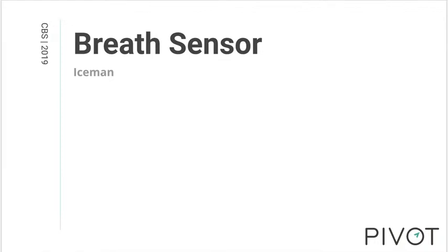In this module, we'll dive deeper into the breath sensor, informally called Iceman, particularly focusing on basic CO technical support, understanding CO values, and how to incorporate the breath sensor into your coaching practice. Now, in the previous module, we briefly described how to pair the breath sensor.